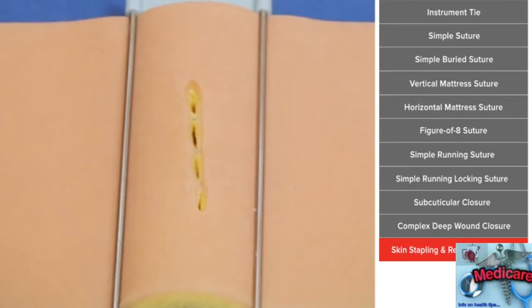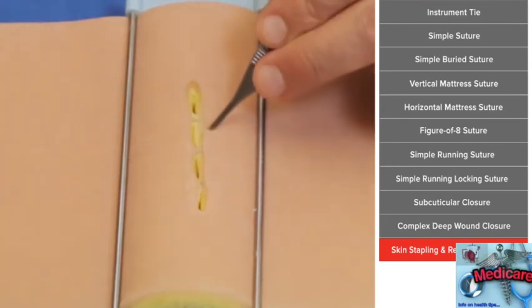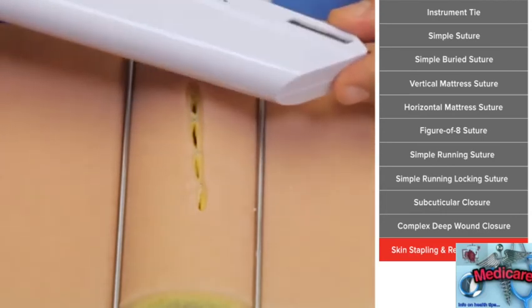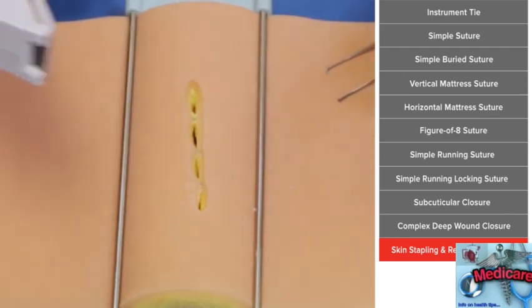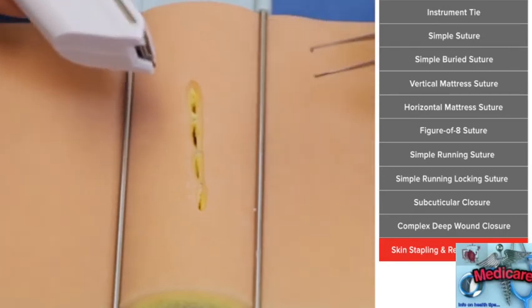Something we do fairly often in the operating room is skin stapling. It seems like it's a fairly simple thing to do, but what I would tell you is approximation of the skin is key. Oftentimes I'll use either 1 or 2 pickups to position the skin properly, everting it, bringing it together, and then taking a stapling device similar to the one that comes with your kit. Simply center the device on the skin, staple it down.